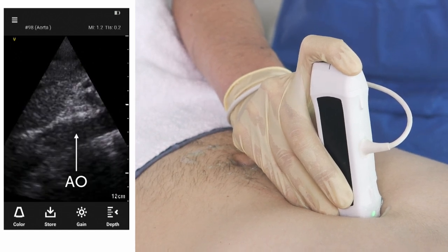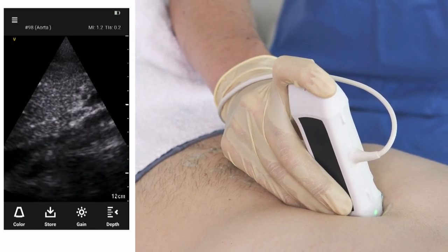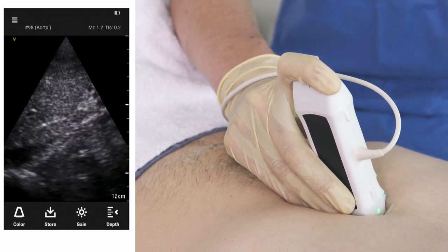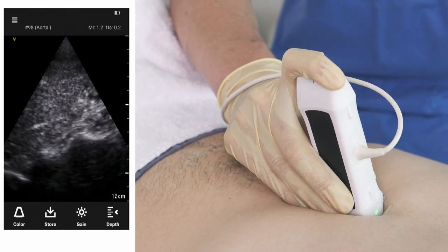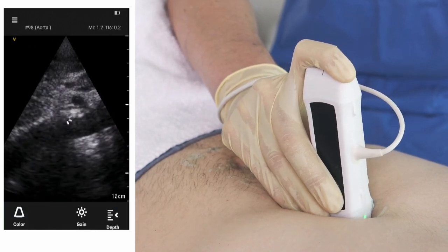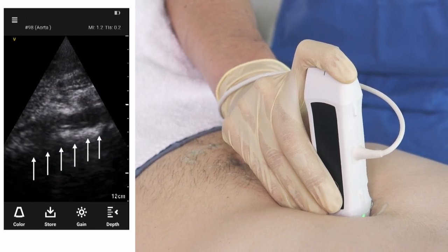If we tilt to the right-hand side of the patient, we are going to see the IVC, which will show the respiratory changes over the breathing rhythm of the patient. Tilting back to the midline, just below the abdominal aorta you see a strong reflection — this time in longitudinal view — which is the lumbar spine.